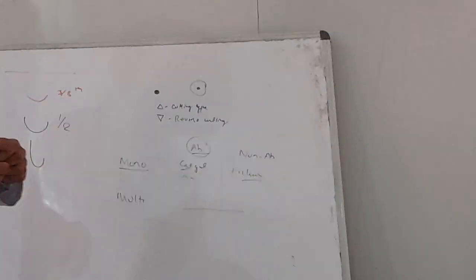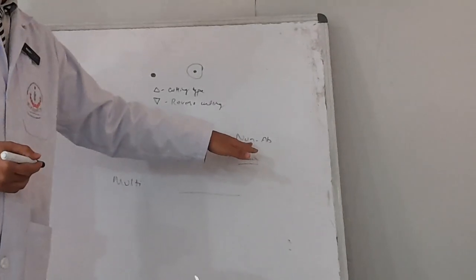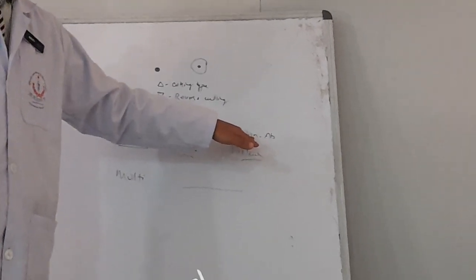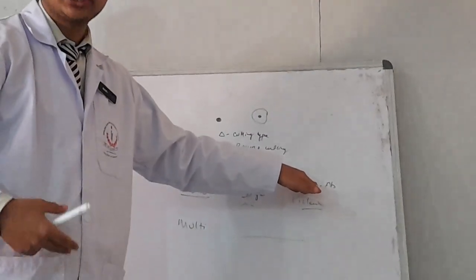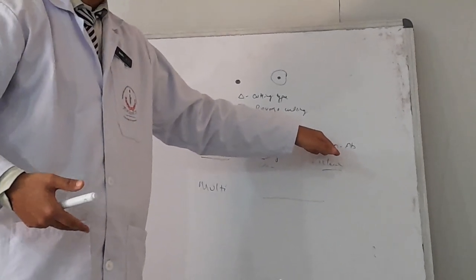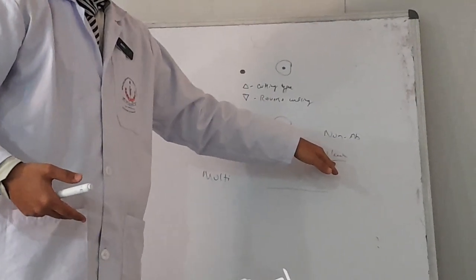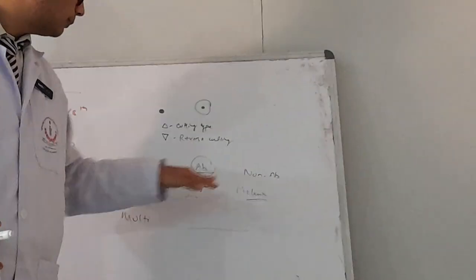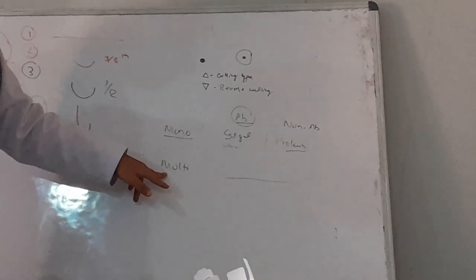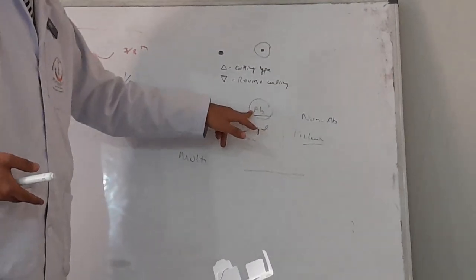Prolene is a non-absorbable type of suture, and it is especially used in hernia repair. While suturing a hernia mesh to the tissue plane, we use Prolene type of sutures. These are non-absorbable monofilament sutures. Now, another type we have is the multifilament absorbable sutures.